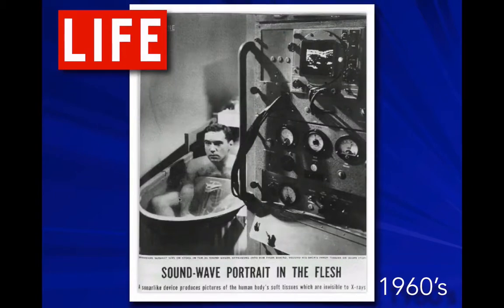This gentleman here is sitting in a big pool of water. Doesn't look very happy to be sitting there with a bunch of electricity and cables coming in and out, but I guess he was doing it for the improvement of science. So good for him and for us.